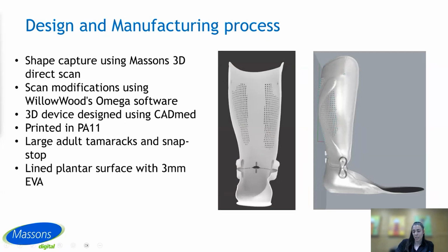So this case was actually the first in-house device made using 100% only digital design and manufacturing techniques. Instead of casting, I used the Massons 3D scanning app to take a semi-weight bearing scan on a glass scanning board. To modify the scan, Willowwood's Omega software was used, and then for the AFO design, we used CADmed.